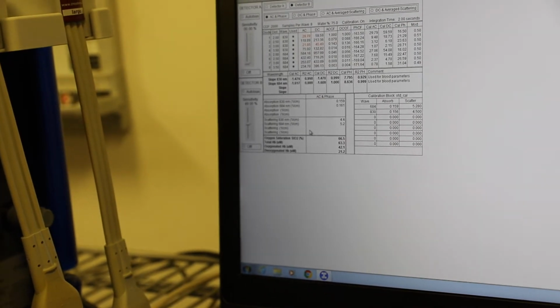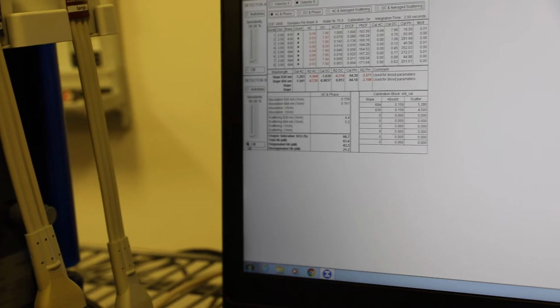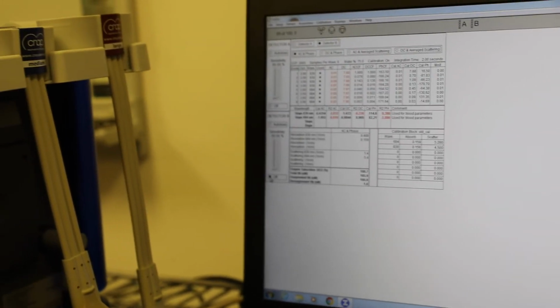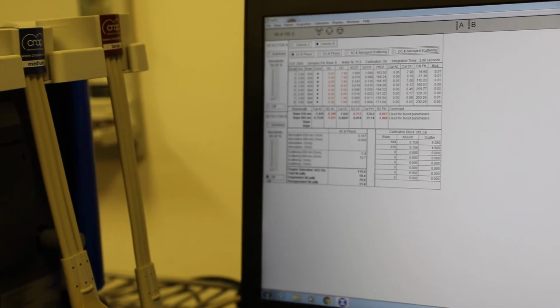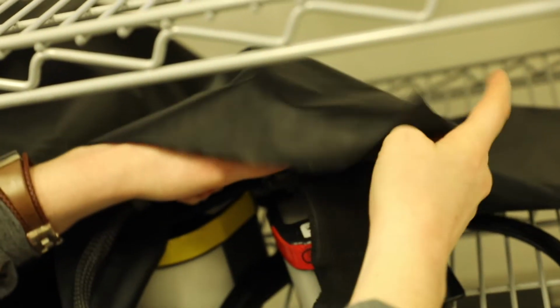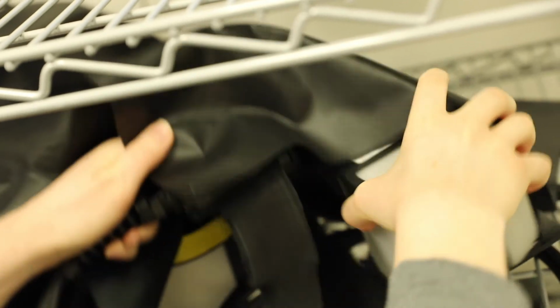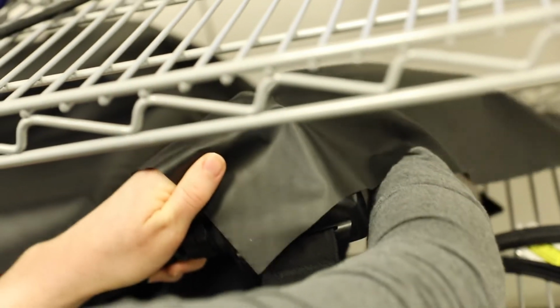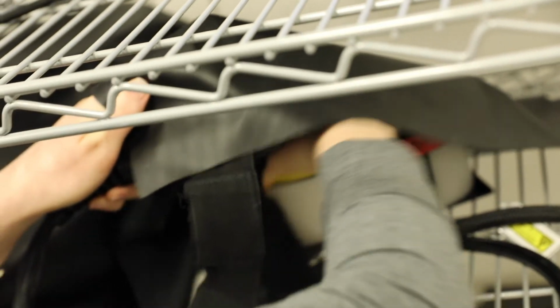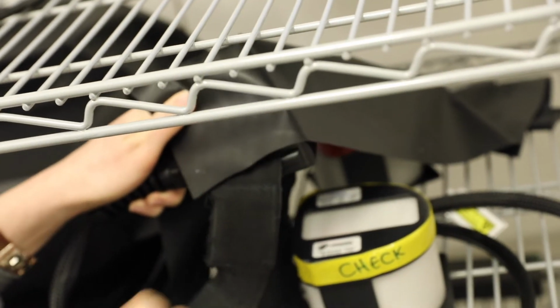So then we're going to come over here and turn the probe off, because we're going to move it. Anytime you move the probe, you want to make sure that you turn it off because it's really sensitive to light. So now we'll come back down to the block and we're going to switch the block. So instead of the calibration block now, we're going to move that one back and we're going to use this yellow block to check the calibration.